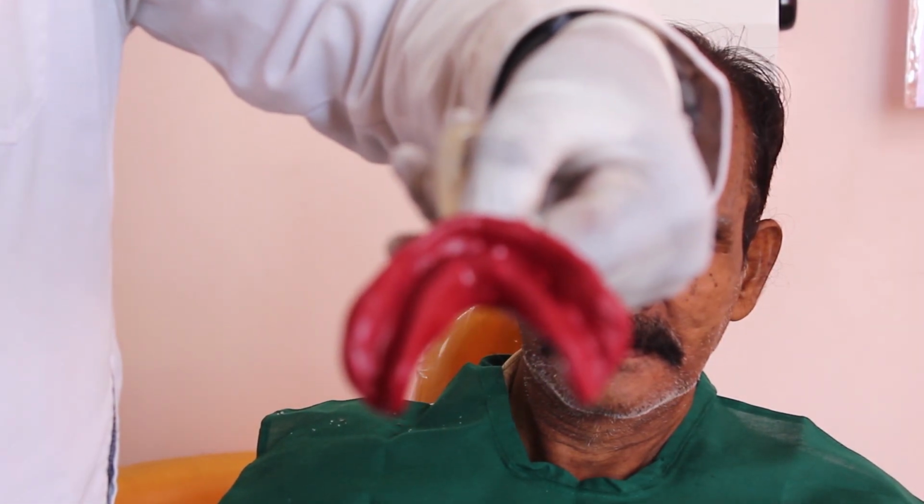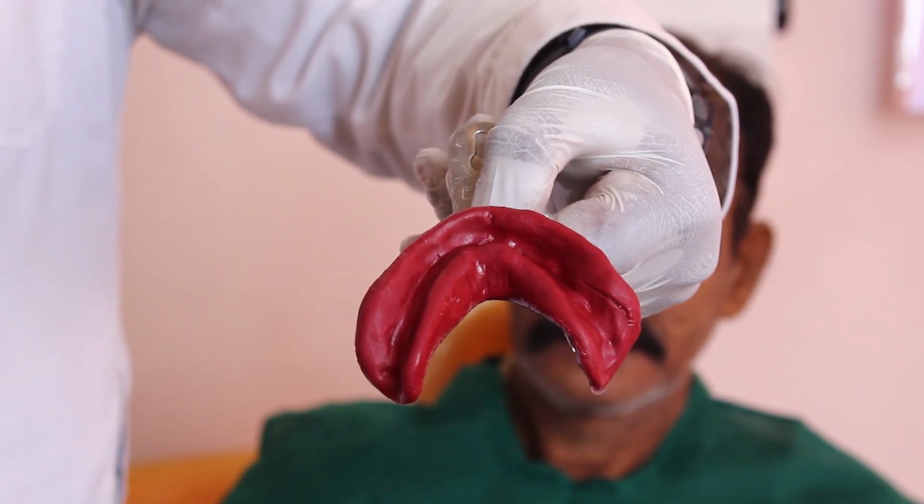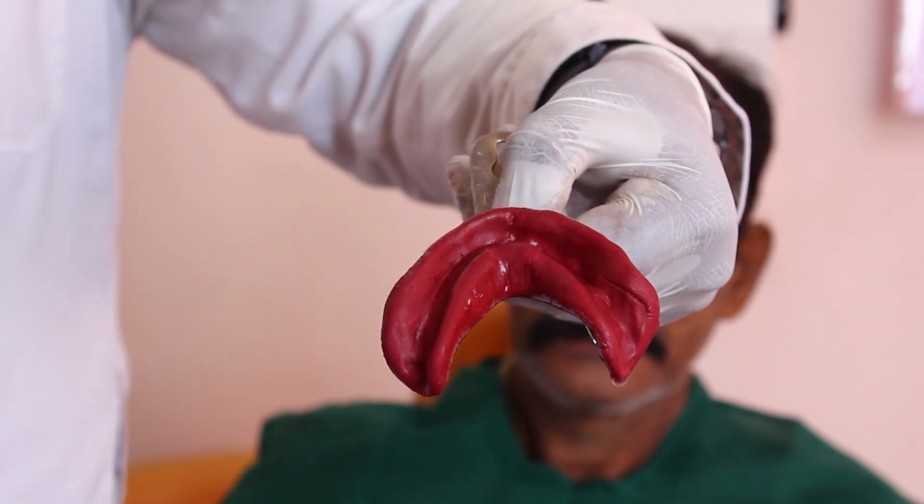So this is the impression. If there is any deficiency, you can add in a segmental way and you can remold it. And if there is excess, you can trim it and then you can remold the particular border.